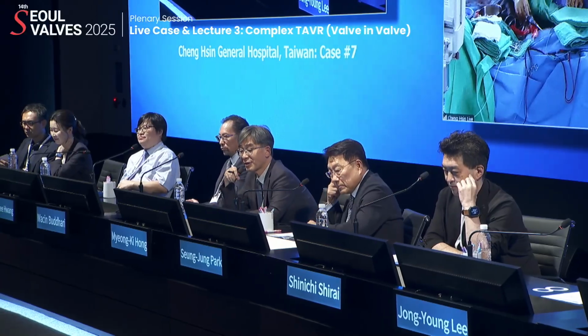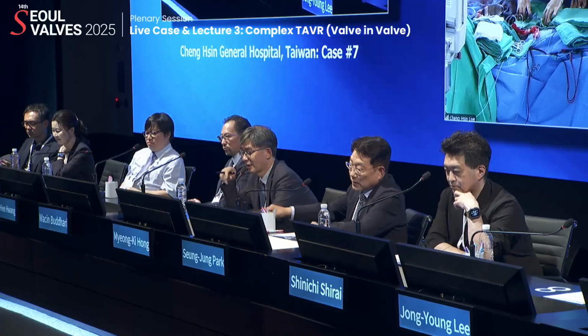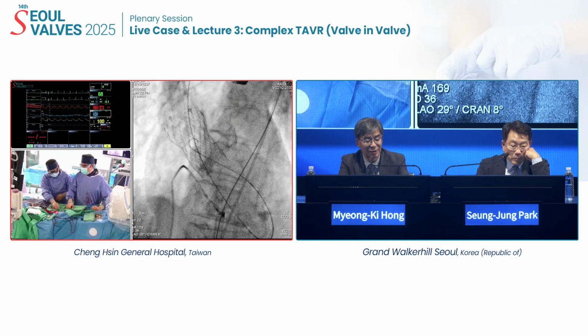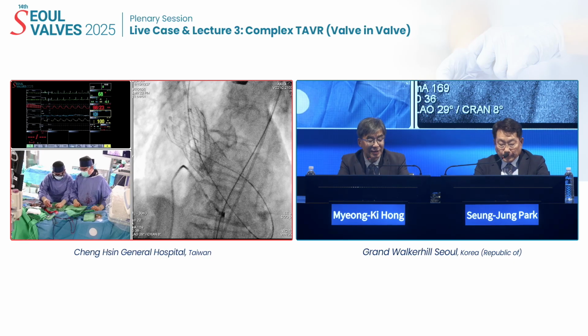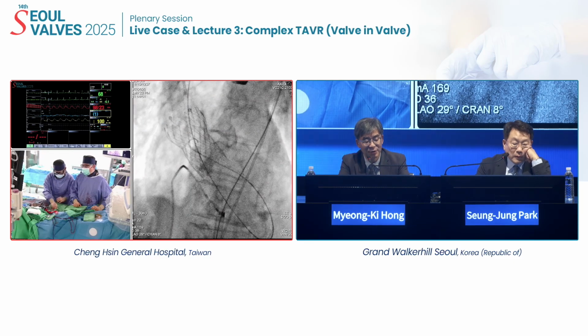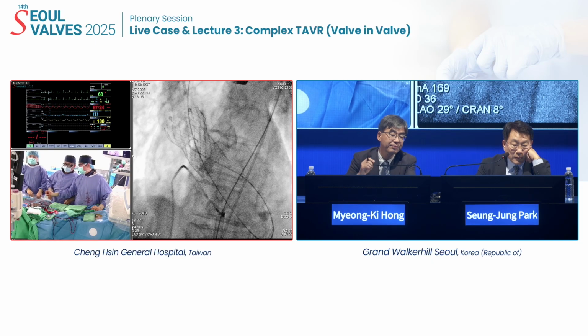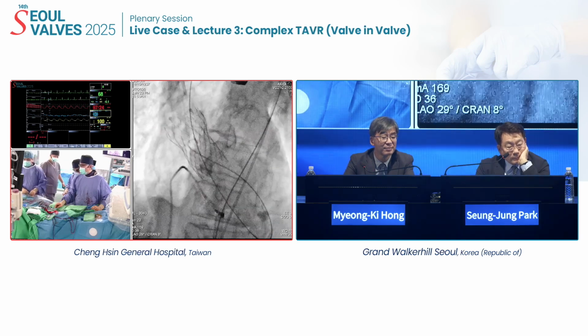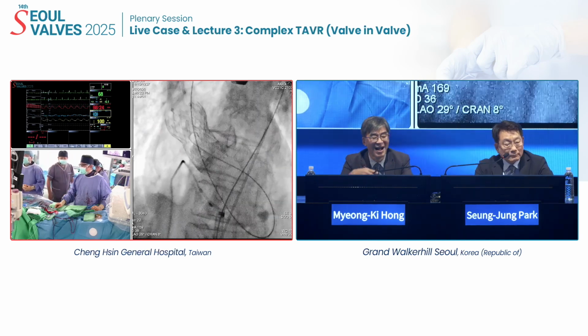Wei-Hsian, are you ready? Hello. Can you hear us? Yeah. I'm very proud of you and your team and your hospital. Thank you, Myeong-Ki. Wei-Hsian, please introduce your patient case and your team. First of all, I would like to invite our team leader, Professor Wei, to say something.